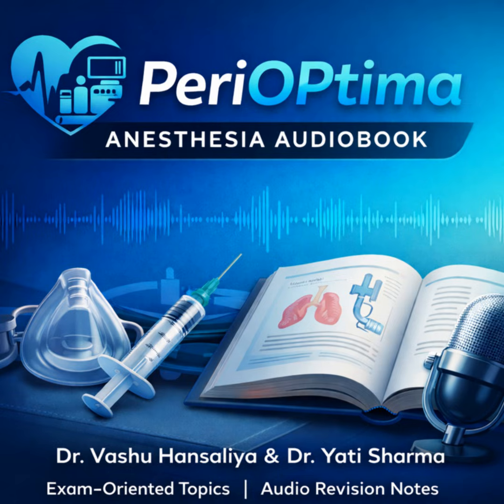And what about the time factor? This is a really important challenge. Getting the view is often very fast. But the time to intubation, the actual act of passing the tube, can be significantly longer, especially for people who aren't experienced with shaping and using the stylet. And more time means more stress on the patient. More apnea time and a greater hemodynamic stress response. Blood pressure and heart rate go up.